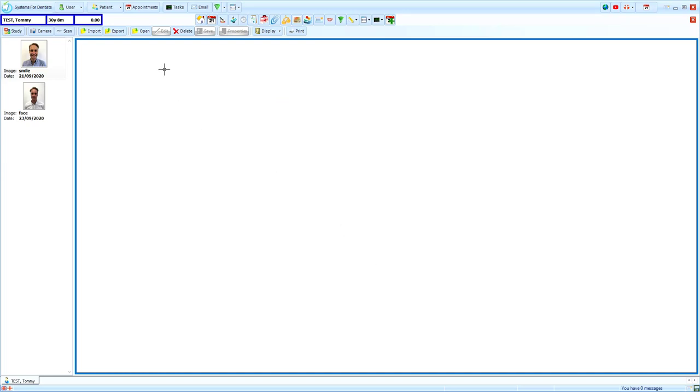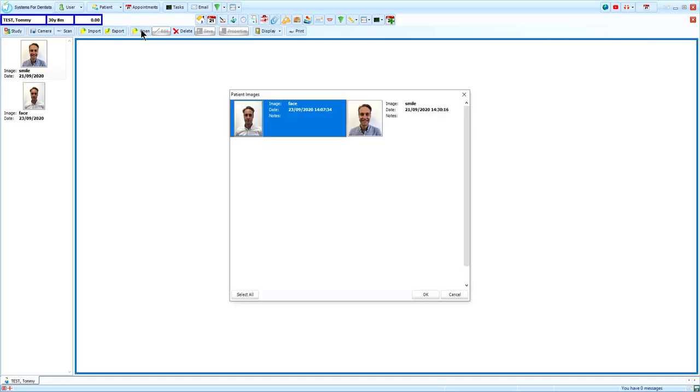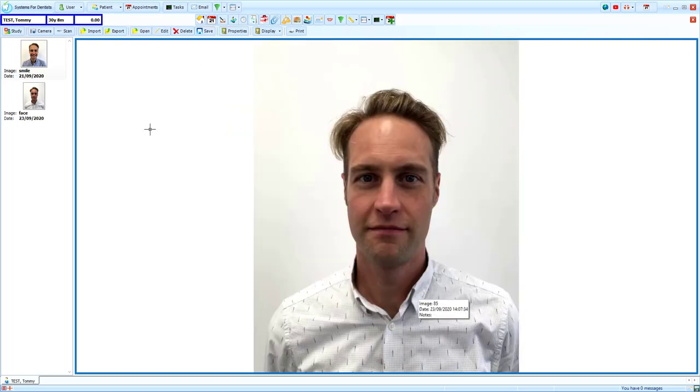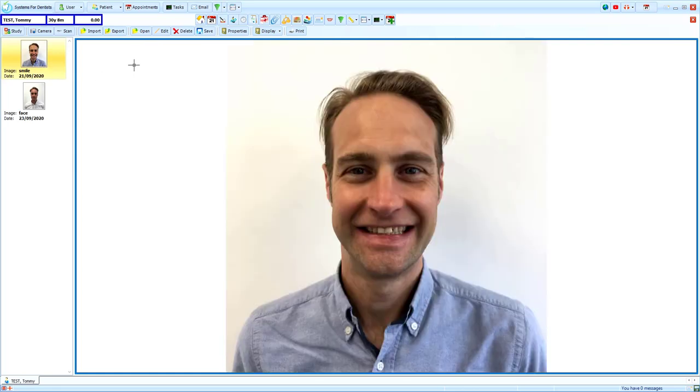To bring an image up in the main section of the screen, you can either select open, highlight the image and choose OK, or you can double-click the image from the column on the left of the screen.